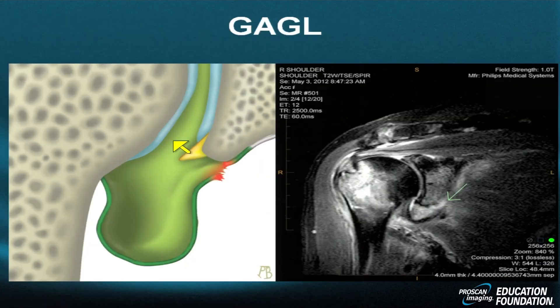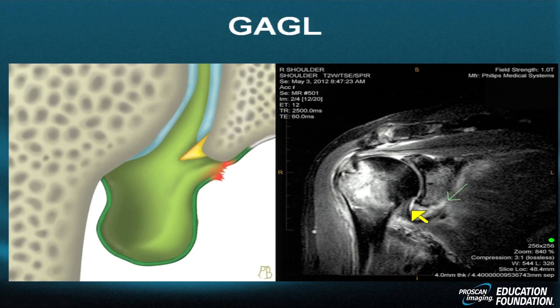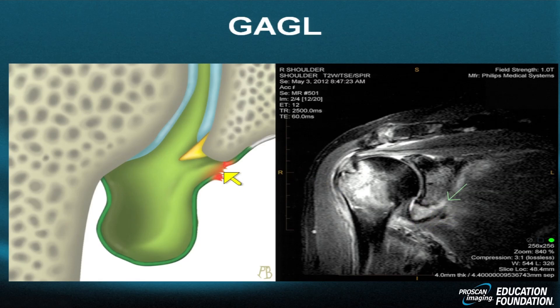Here's a true GAGL with the accompanying diagram. The labrum is in its perfect position. The hyaline-labral interface is undisturbed, as in the prior case. Here is the labrum — very swollen and gray — but in the proper relationship with the cortex and adjacent hyaline cartilage. The capsule is distended inferiorly, which corresponds to the tear of the glenoid side of the inferior glenohumeral ligament.